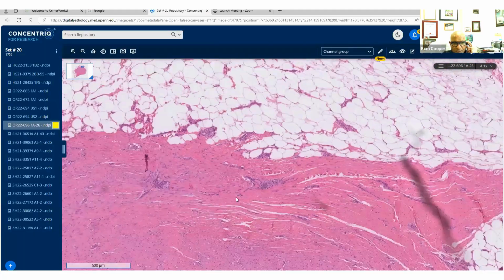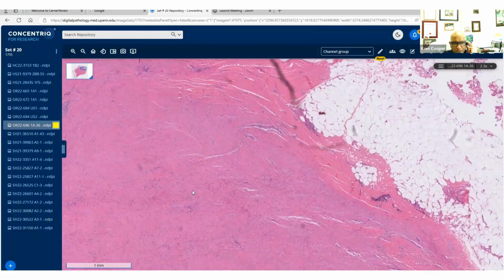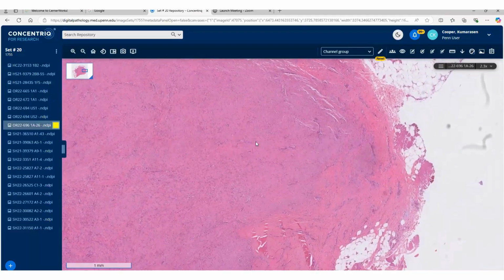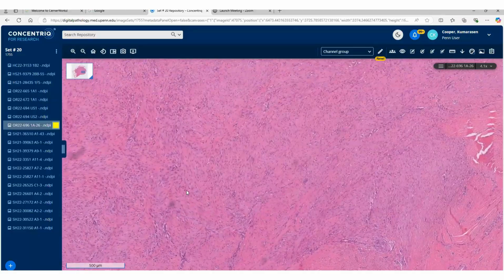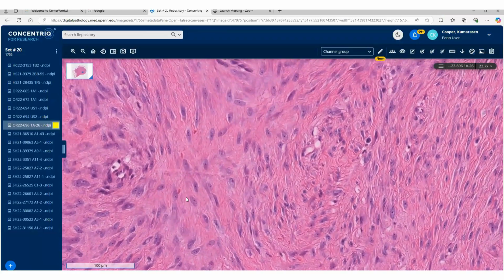Again, 1.6 centimeters, thigh mass, subcutaneous fat, adult male. Dr. Cooper? Yes, sir. I would argue that, in my opinion, one of the single best features for this lesion, which I assume to be a desmoid tumor or a fibromatosis, is the perivascular edema.